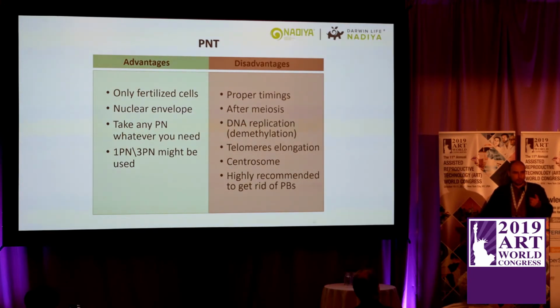Or if you put two centrosomes into one cell, you will have direct cleavage. So it's abnormal cleavage when the zygote cleaves to 3 or 4 blastomeres at the same time. So it's not the thing that you want from this procedure. And as far as you cannot see the centrosome, it's a problem.